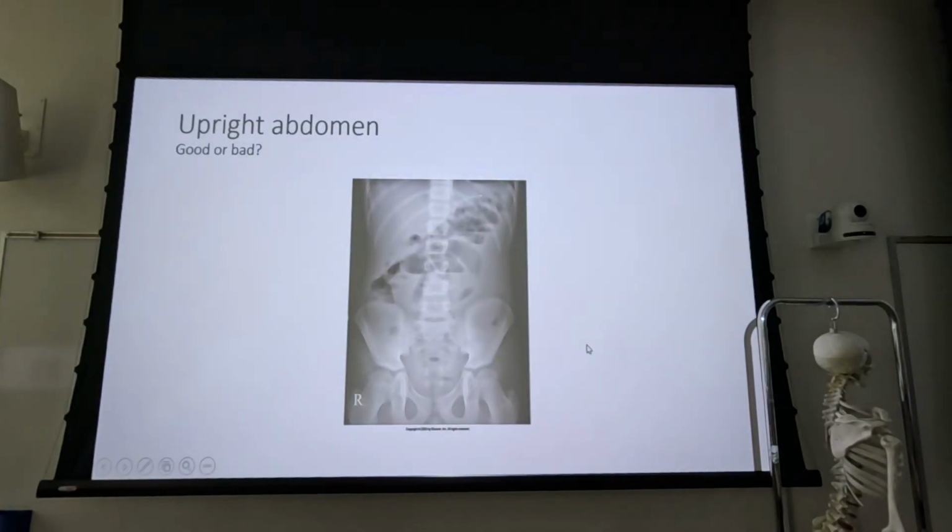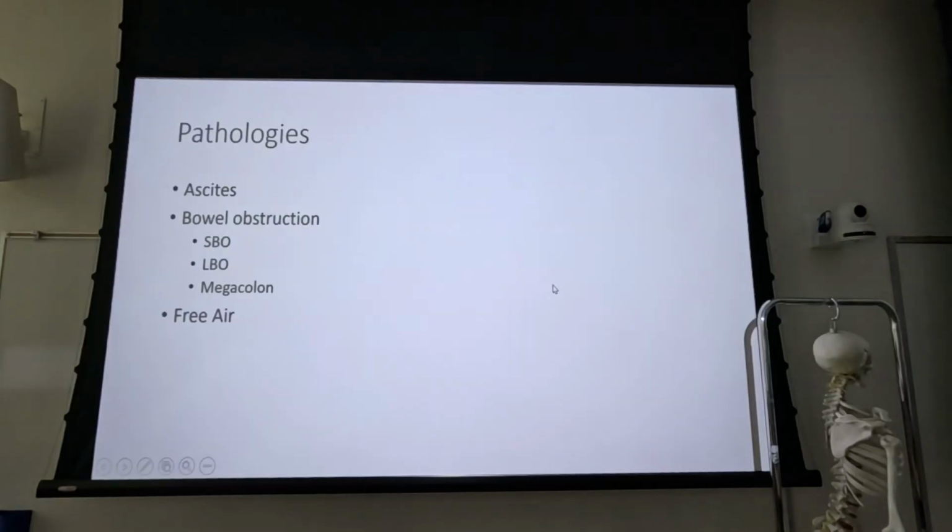Okay, so what do we see on this one? No diaphragm. No diaphragm. So what's your doctor's protocol, right? So if they need to see free air, this is a repeat, but you might want to consider just using, you know, from maybe the iliac crest up. But we also see air fluid levels, so that might be what they're looking for, right? So again, pediatric patient, you can tell because the pelvis, you know, you got still open epiphyseal plates. You might want to check before you go back and reblast this patient.